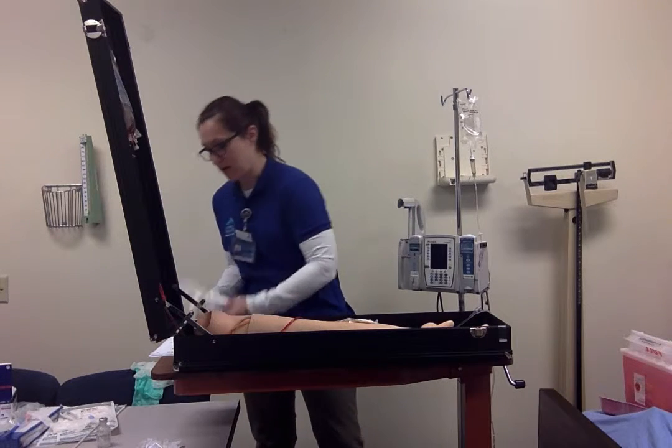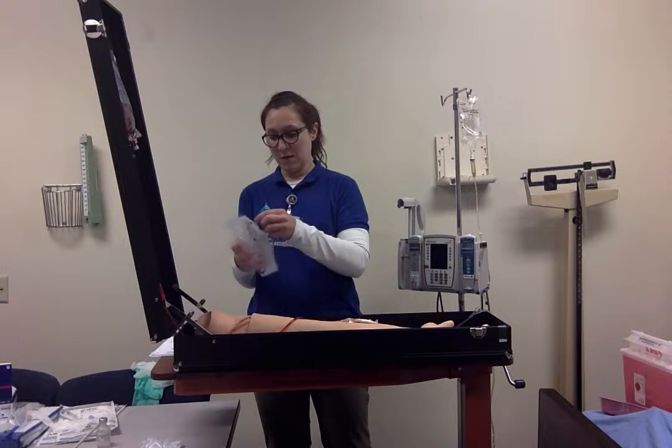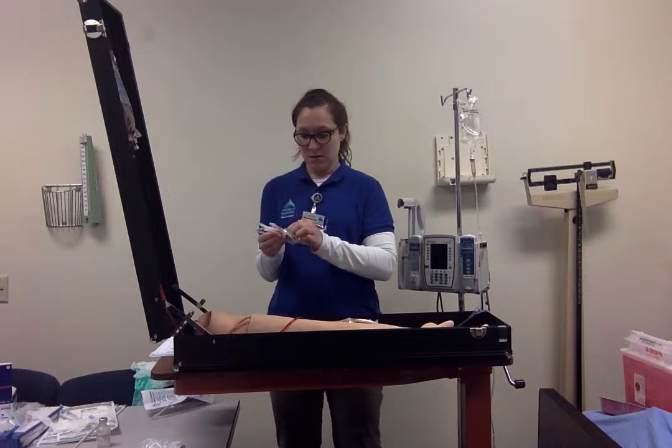So I have my sterile piggyback that I'm going to take out. Get that ready.